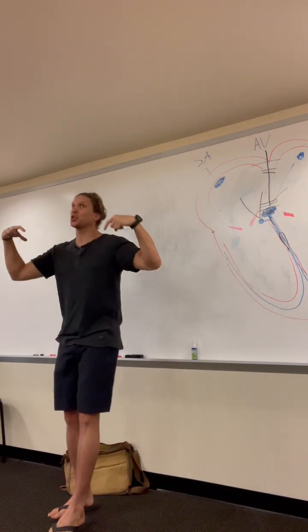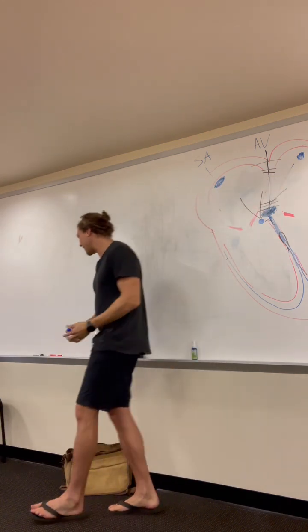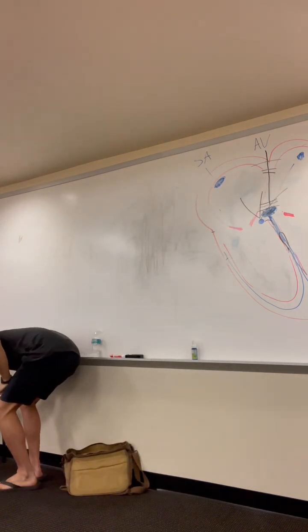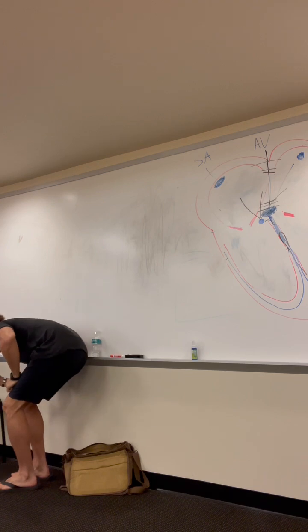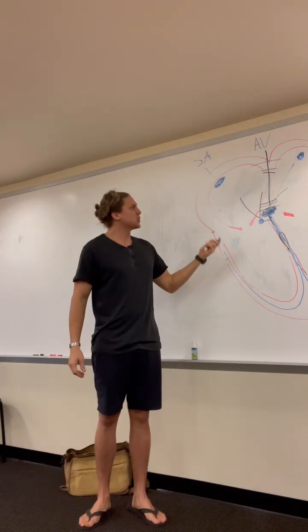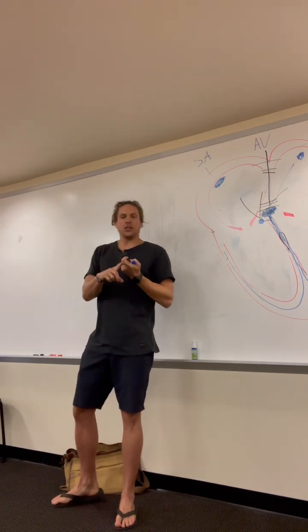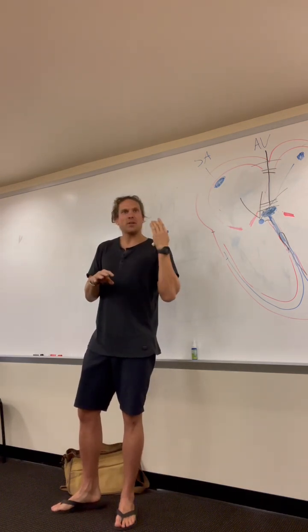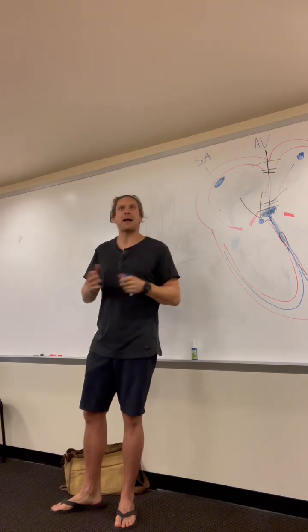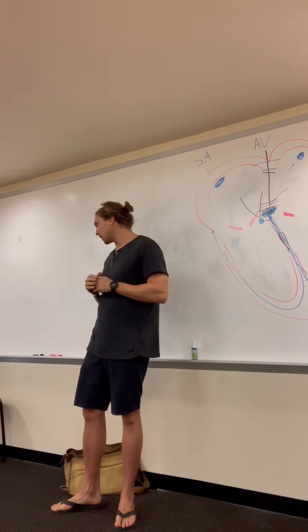The P waves should look different because it came from a different place in the heart. This one's not a great example of that. They look pretty similar to me, but if you could zoom in, you'd probably find a difference. Sometimes they're super different. So that's what a premature atrial contraction is. If you use my method, you don't have a P to Q mismatch. There's the same amount of P's to Q's, okay? And that's your hint that it's not a heart block.